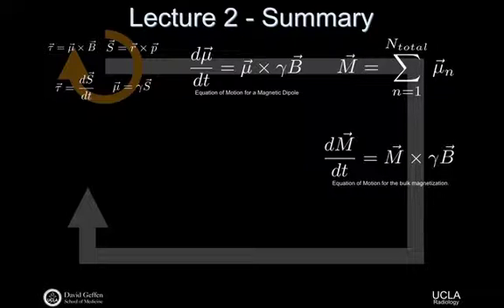What coordinate frame is this system of equations describing the bulk magnetization's behavior in? What coordinate system? The laboratory frame, right? And so today's job, and we'll get into it as much as we can, is to transform that set of differential equations into the rotating frame, where now we're suddenly moving with the spin system, because it turns out things are mathematically a lot more convenient, and it's just easier for us to observe and understand if we're in that coordinate system.